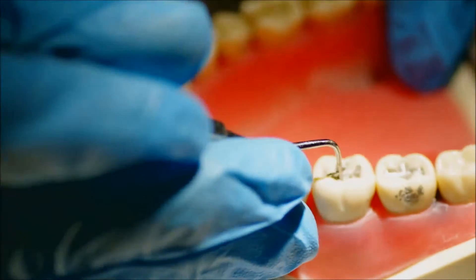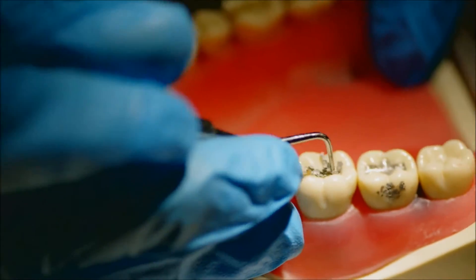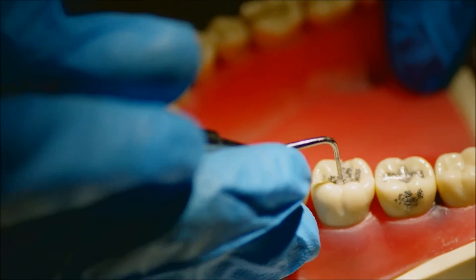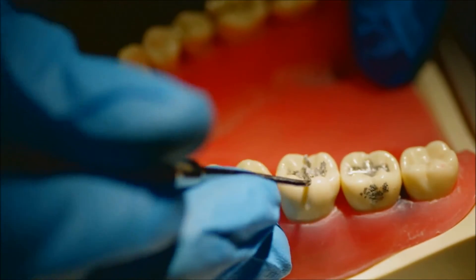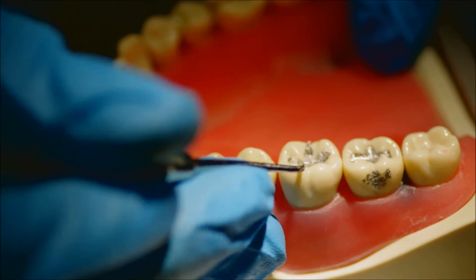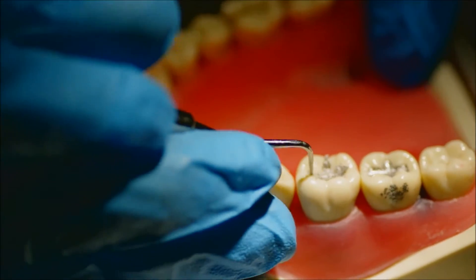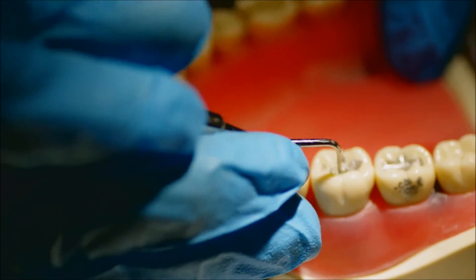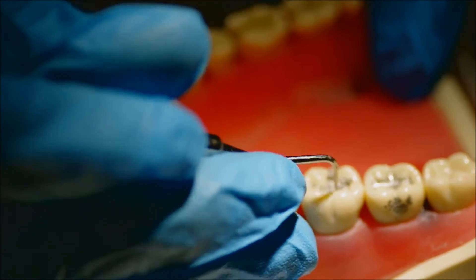You pick it up with your amalgam transporter and place a small amount in the tooth, and what you can see me doing right now is condensing that first small amount with a small condenser. You don't want to fill up your entire prep volume.